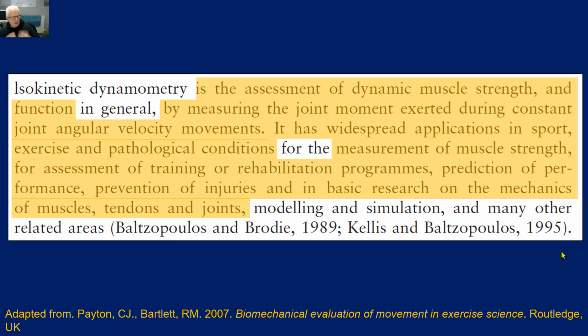It's related to the assessment of things like training and rehab, so we can use it to monitor and evaluate athletes and clinical population groups and non-athletes alike. And it really gives us a much more defined exploration of muscle physiology under different loads and different angular velocities than we would see, for example, if we were just doing something like an isoinertial strength test.